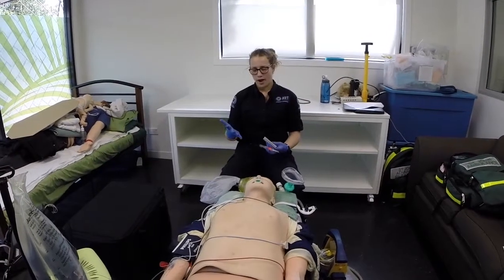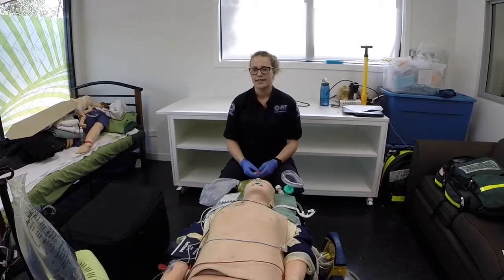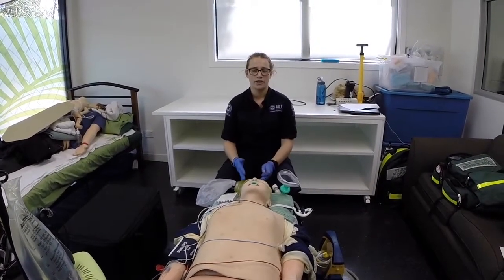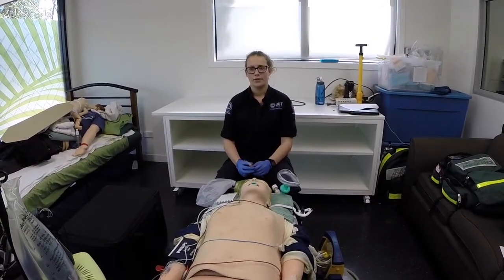Also, before the arrival of the RSI officer, an ILS officer should know the failed intubation drill, as well as the burp maneuver.